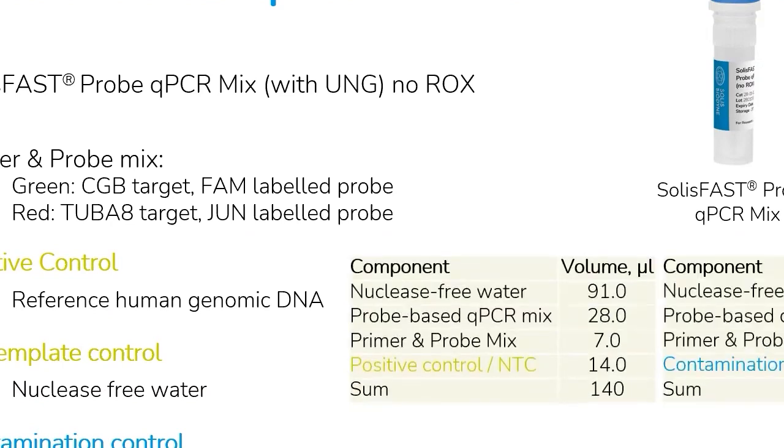In these tables, you can see the mixing protocol of reagents. The overall reaction mixture protocol does not differ much from regular PCR. The total volume is 140 microliters, from which 130 microliters is pipetted into the Fluxergy PCR card, which will then be divided into 6 technical replicates within the microfluidic test card, hence the rather large mixture volume.